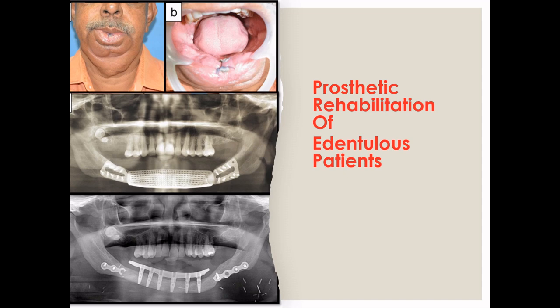The success of edentulous mandibular resection prosthesis is directly related to the amount of the remaining bone and soft tissues. If the tongue is broadly resected during the mandibulectomy procedure, the valuable vestibular extension regions may be obliterated after surgery. So such cases are a real challenge for the clinicians. And in these cases, the complete denture's main purpose is to provide and improve aesthetics. They improve the lip and cheek contour and replace the missing teeth.